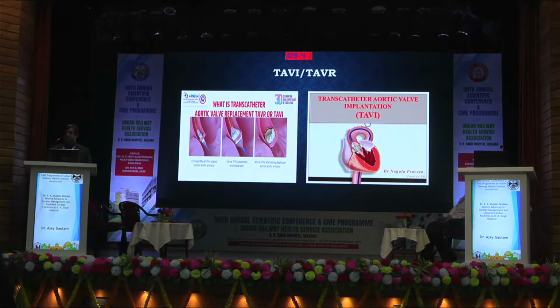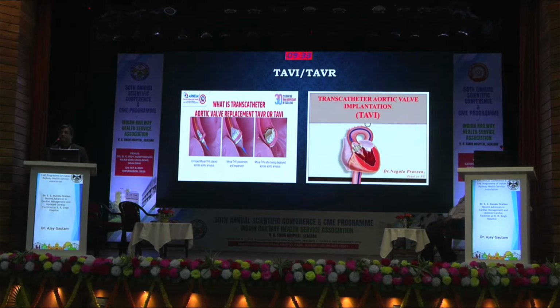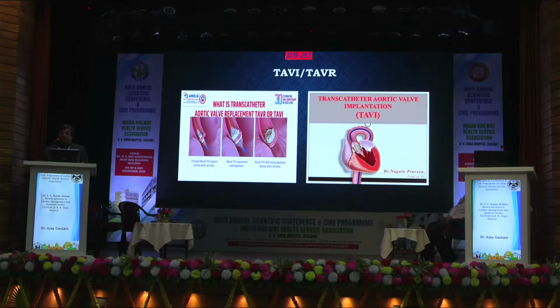So this is TAVR or TAVI, which is catheter based. You can see there is a balloon-mounted valve which is placed in the aortic position, and recently we have self-expanding valves also. It is very convenient, especially in elderly frail ladies who are not candidates for surgery. They are going for this procedure very well and doing well.